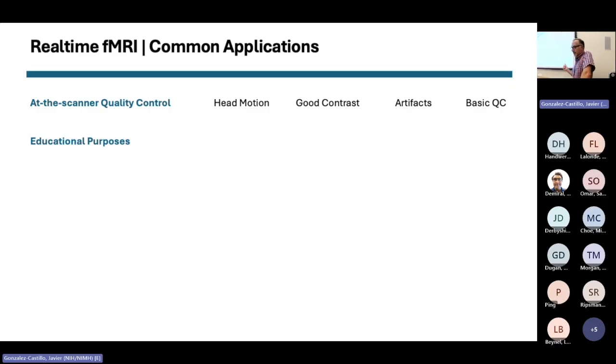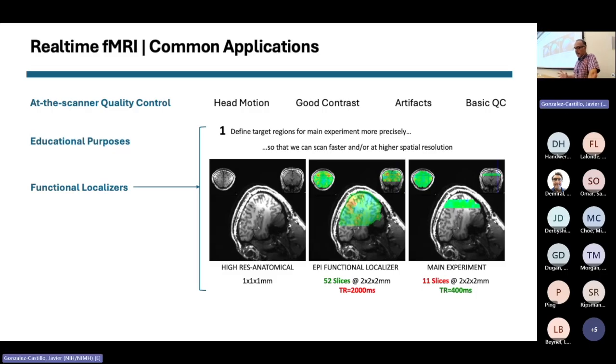So it can really help with increasing the interest of students, with understanding how things work. We use it here quite often for visitors. We have a basic neurofeedback experiment and a basic block activation in visual and motor cortex. Very, very helpful.